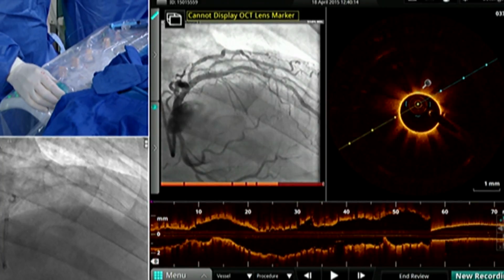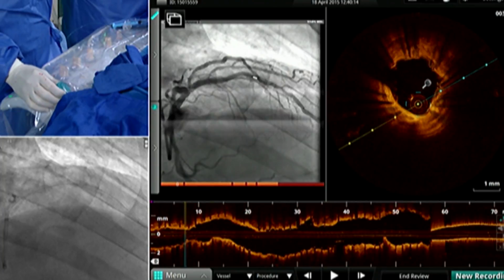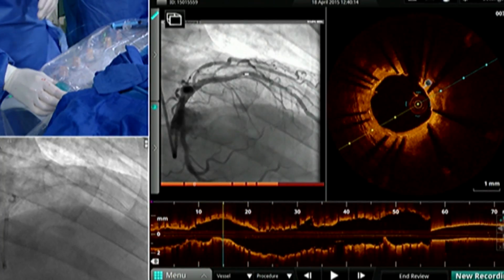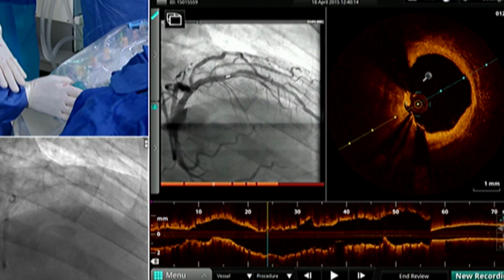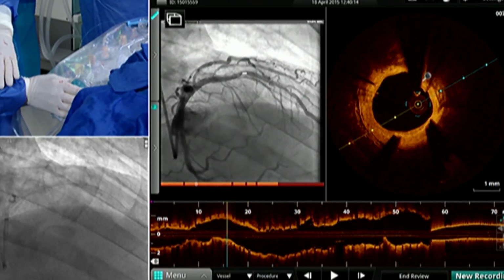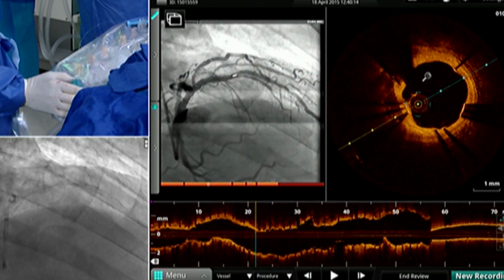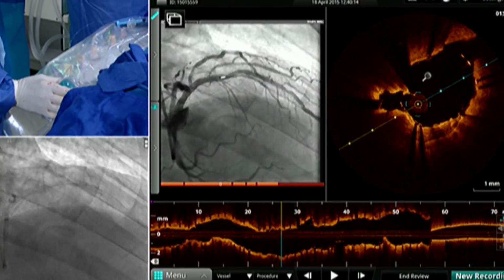When we are crossing some branch, it becomes red due to the fact that there is some inertness, and then we are going back. So quickly, we are checking what we have done today. This is the new stent that has been placed. The plaque in between is not important at all. There is a small, I think, minimum gap, but it's okay.